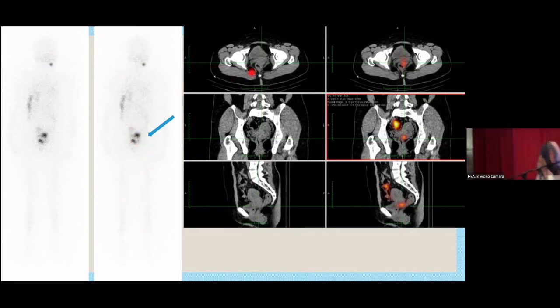So when we did a SPECT-CT, it turned out there's an uptake at the cervix region, and we referred to gynae. They did a sampling. It turned out to be non-malignant, and it is a nabothian cyst, which means that the skin trapped the mucin from the cervical gland.